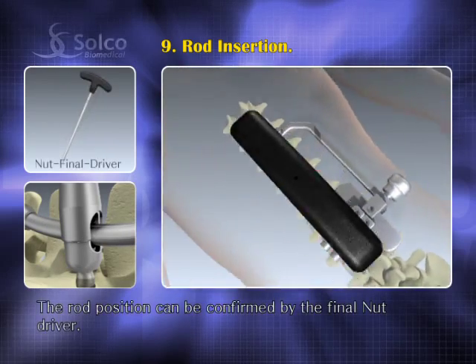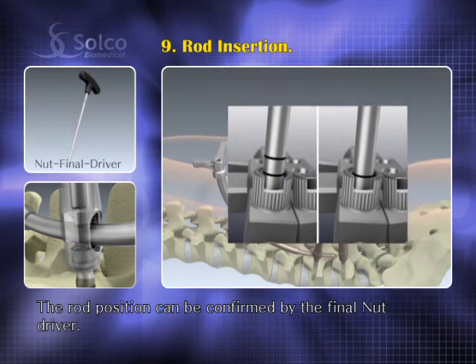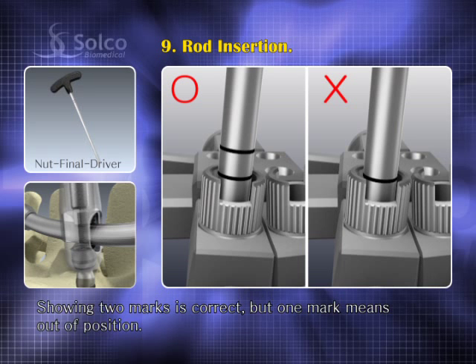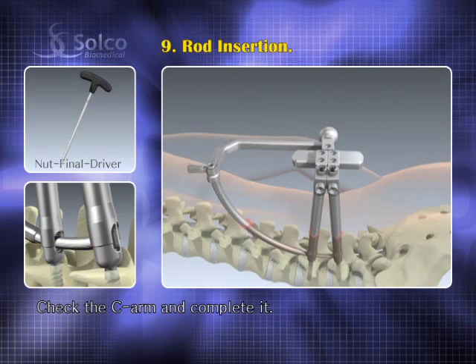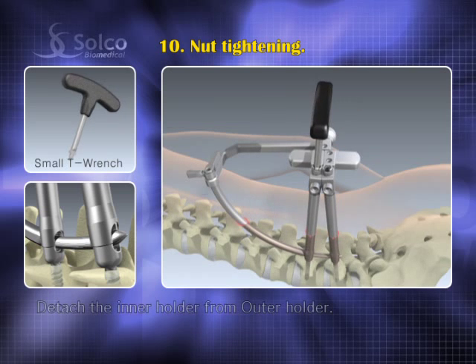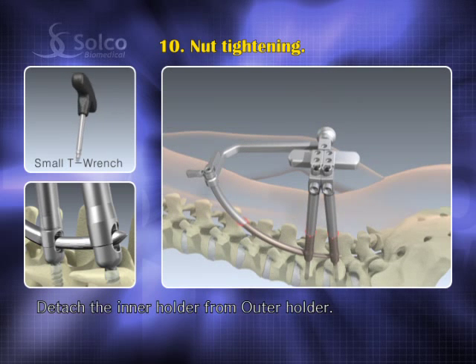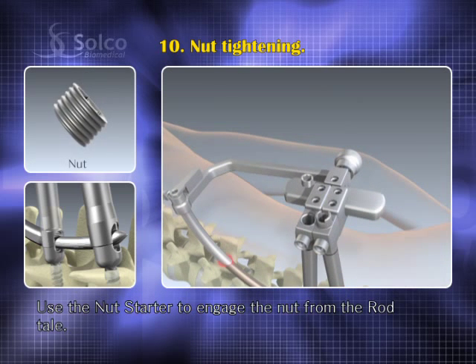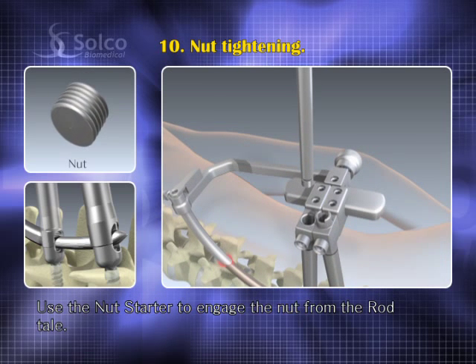The rod position can be confirmed by the final nut driver. Showing two marks is correct, but if only one mark is visible, the rod is not in the screw head. Check the C-arm and complete it. Prior to nut tightening, detach the inner holder from the outer holder using the small t-wrench, then use the nut starter to engage the nut on the screw head from the rod tail.